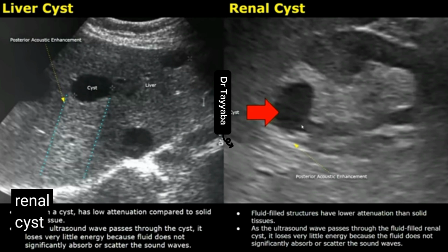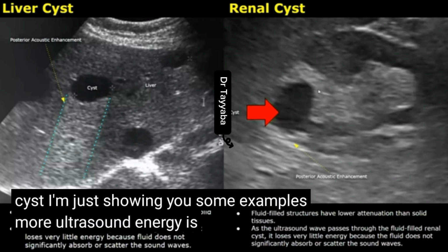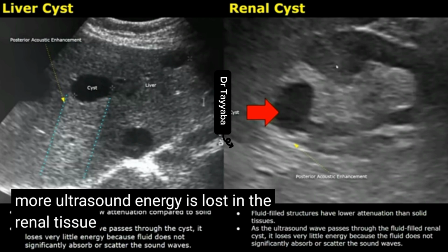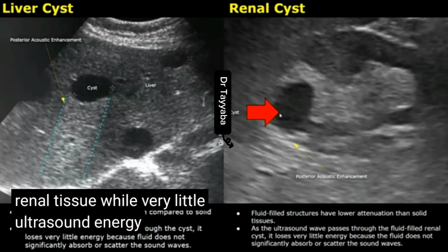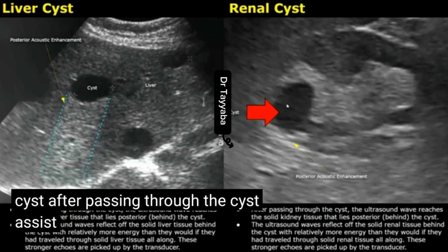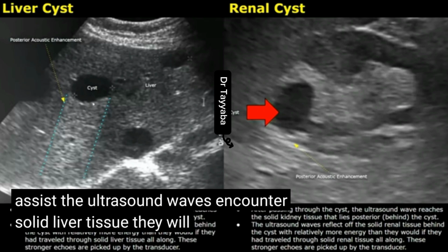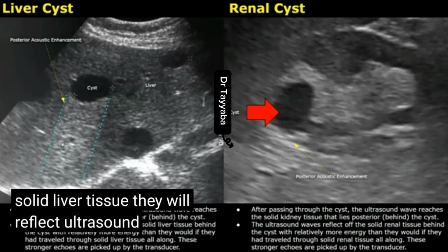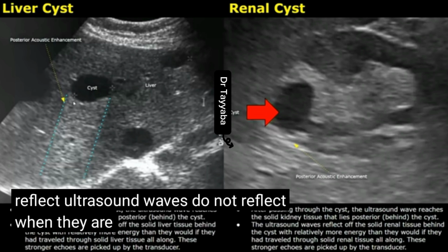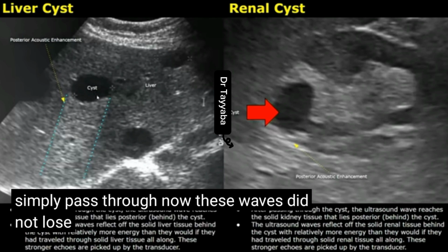The same phenomenon applies to a renal cyst. I'm just showing you some examples. More ultrasound energy is lost in the renal tissue, while very little ultrasound energy is lost in the cyst. After passing through the cyst, the ultrasound waves encounter solid liver tissue. They will reflect there, but ultrasound waves do not reflect when they are inside a cyst. They just simply pass through.